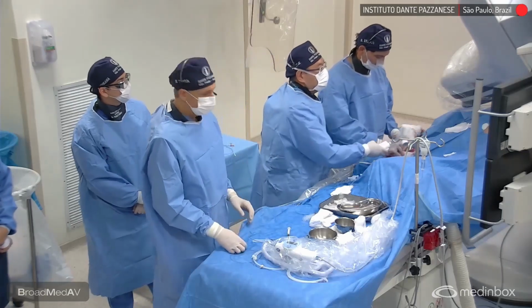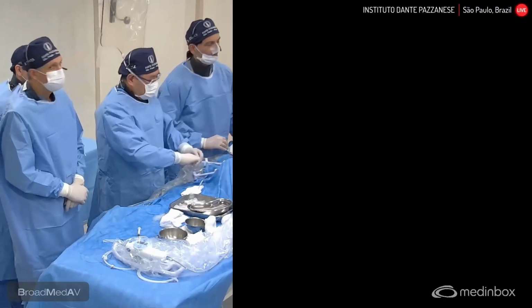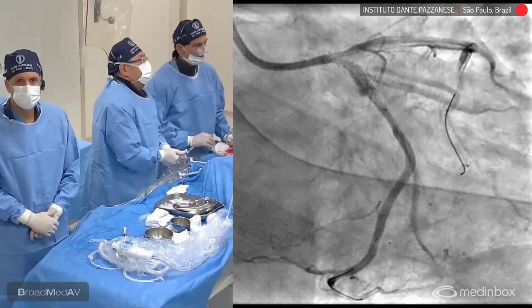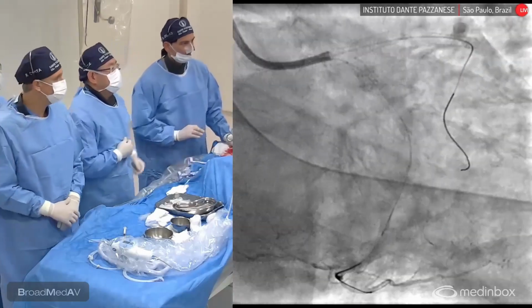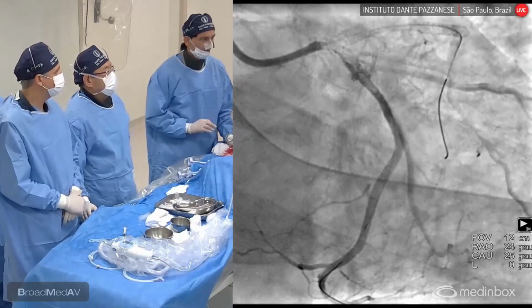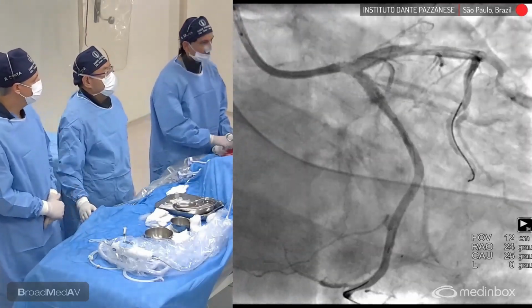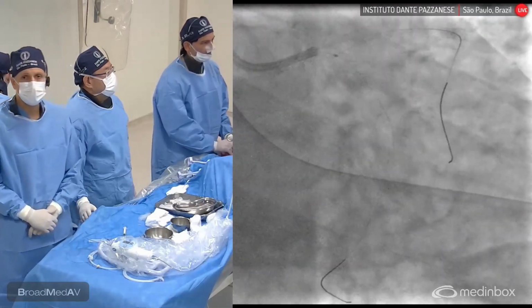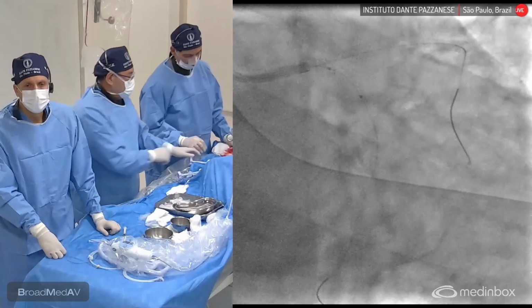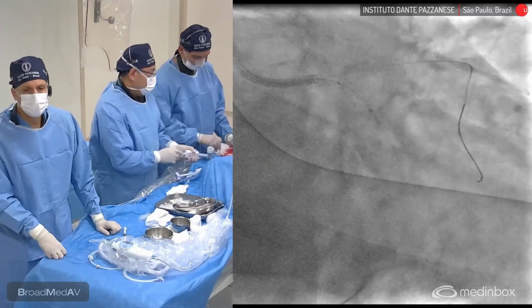Yes, can I have the angio here, okay? Okay, so we have balloons there. Looks like a very acceptable result, right, Rodolfo? Yes. And I think this patient has all the possibility to evolve in a positive way. So we do some extra balloon here.